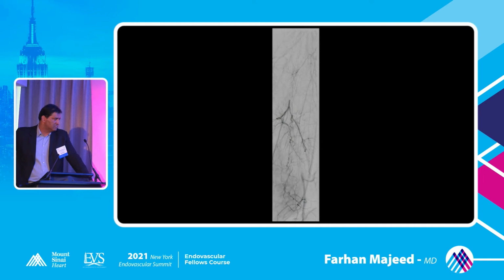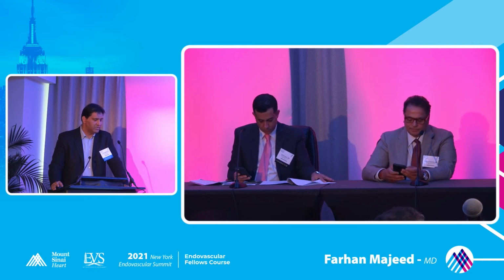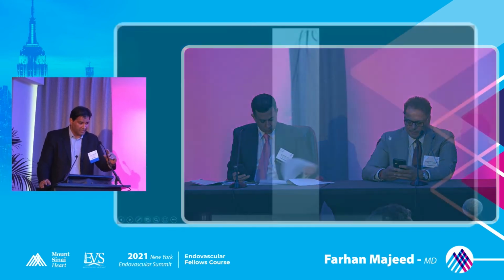With the ISR, you may also have a proximal cap that's stenotic, and then a distal cap that's obviously occlusive. But in the mid segment, you can get a collateral from your profunda, which is filling, which may leave what we call loosely sludge inside that stent. So you may fight through the proximal cap. Mid may be very fast, distal may be a fight, but in your mind you have to know that. That's why every part of the procedure you have to learn from and react to the feedback you're getting. Right, so we have significant disease and thrombus here.